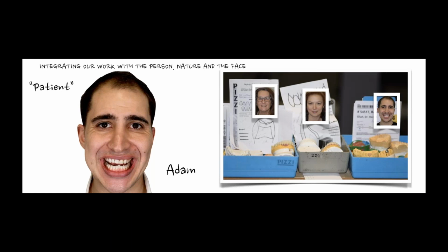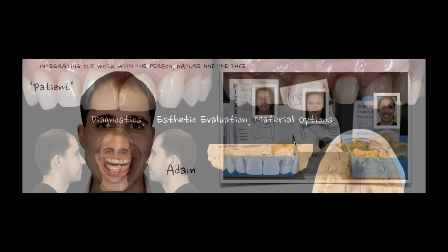If the case is in the model and die department and we're trimming a cast, or the case is upstairs and being digitally manipulated, I want to look at that face and make sure that I understand where the white belongs, where the pink belongs, where the horizontal plane is. So that's become pretty much a standard here in my laboratory for a few years now.